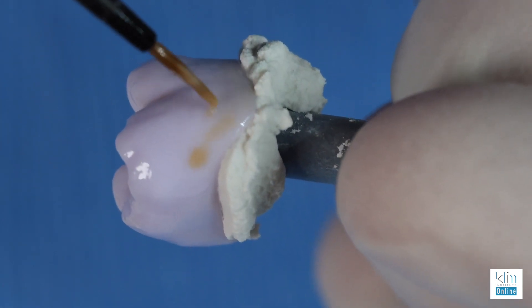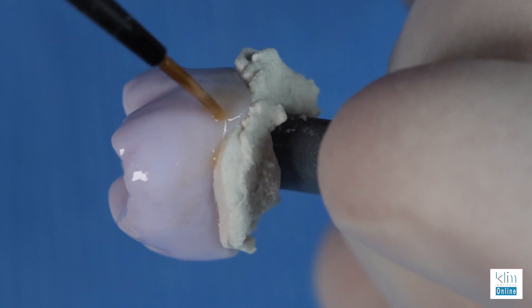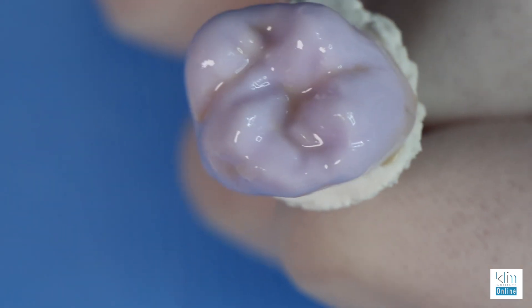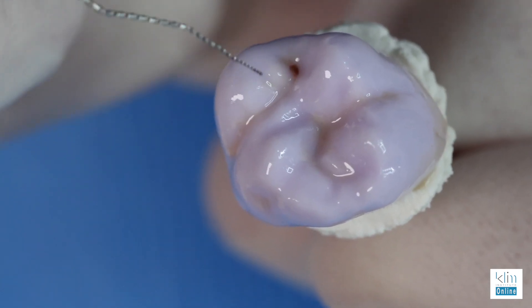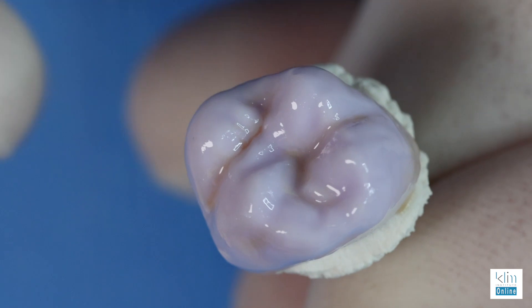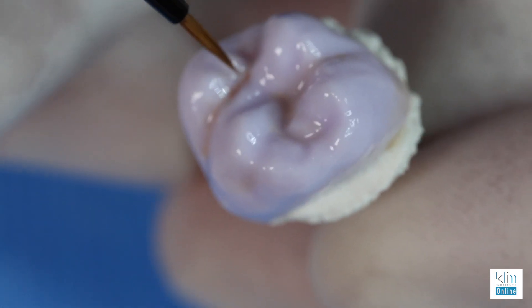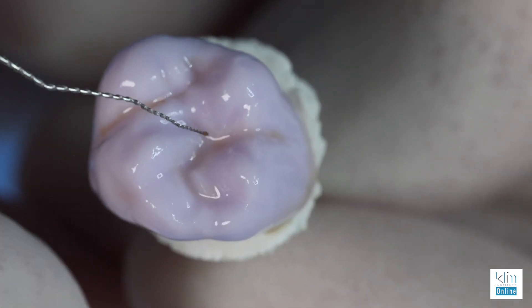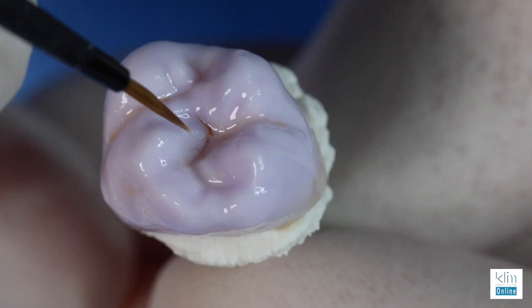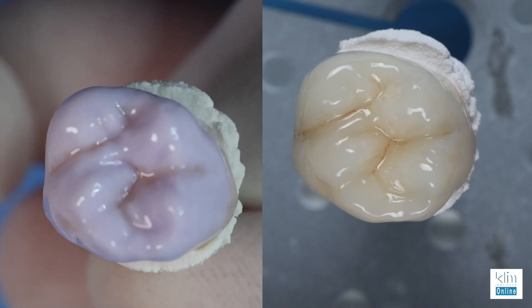As you get experience, you'll get a feel for how much saturation and the level of chroma you're going to apply here. You do want to feather it, and you'll find that this material doesn't really blotch — it's more translucent, and that's the beauty of the meal system. We're adding some warmth, and I know what some of you are thinking — my patients are going to complain, and some of mine will as well. However, I'm very sensitive to the patient. So when we do add the warmer brown shade, I'm using an endodontic 15 file. We add the color and then remove it with the brush — that's the way we handle both brown and white. You apply oversaturating and then take the tip of that refined brush, neutralizing it, mixing it into the prior dentinal shade, and you'll see the final effect is just gorgeous.